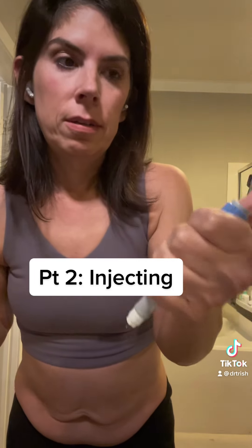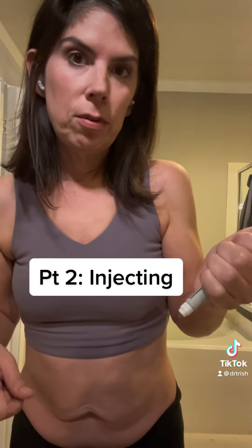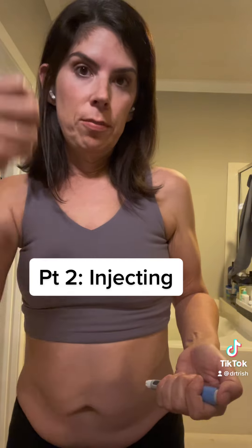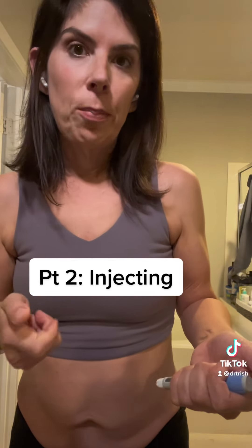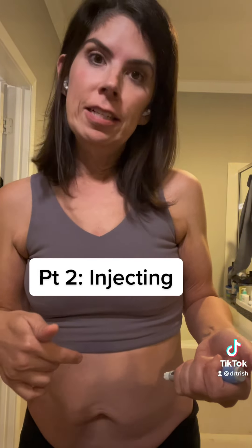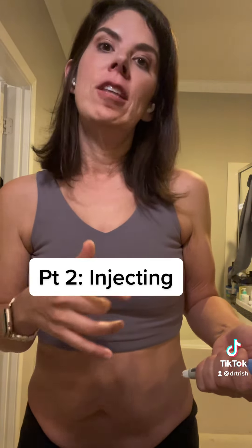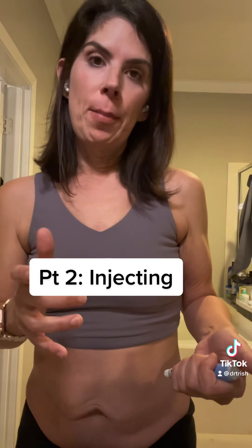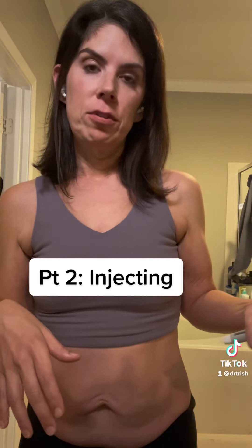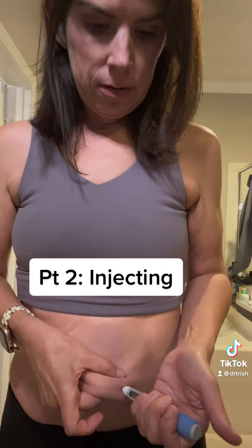With this pen you can pinch your skin or you don't have to. With the auto-injectors for Trulicity and Mounjaro, you just put it flat against your skin — once you push the button it will propel the needle into your skin. Hold it until the needle plunges in; it sounds unpleasant but that's what happens. You'll feel the needle go in, feel the medicine go in, then feel the needle come out and hear a pop. Wait about five more seconds, then you can take it off your skin.